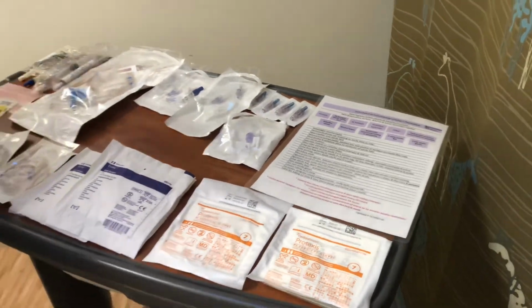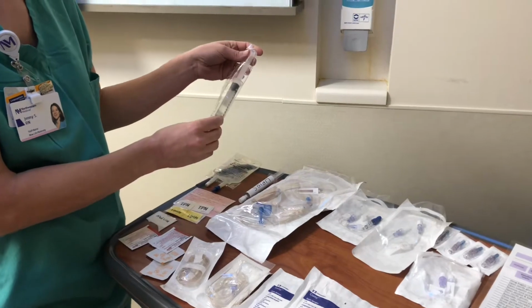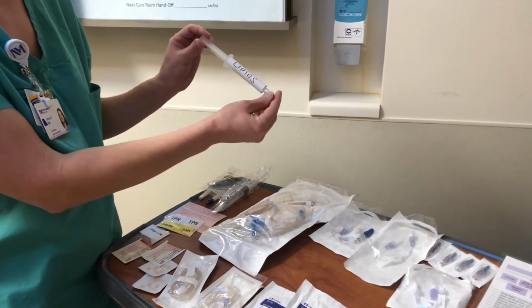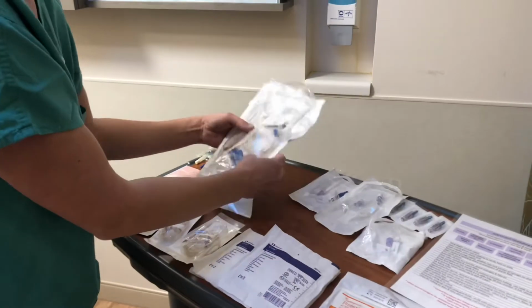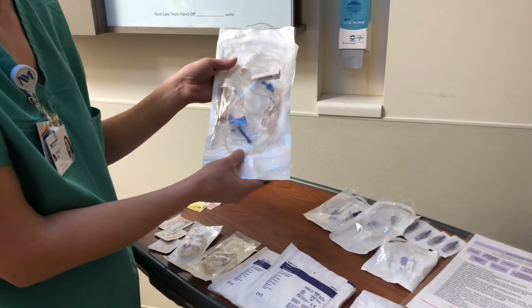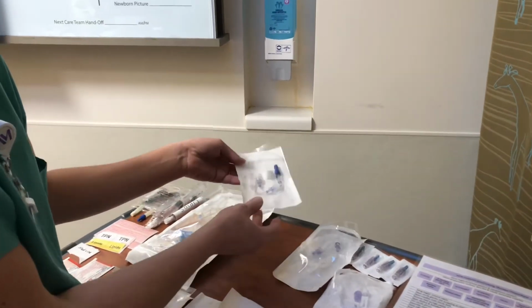We'll start off with our IV fluids that come from pharmacy, any IV syringes you will need for your medication line. I've used this to show our lipid tubing, our lipid syringe. And then next on the list is our IV fluid tubing. And then our IV filters and our lipid filters.